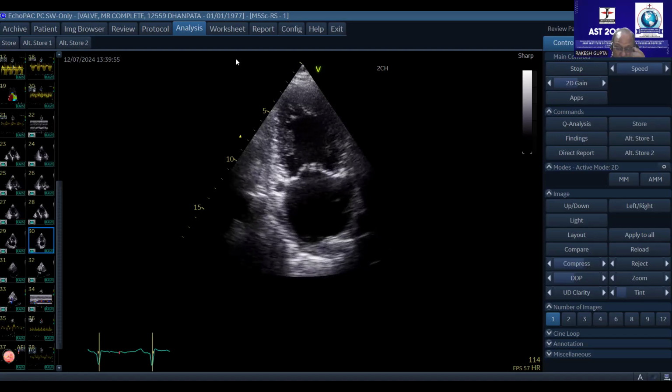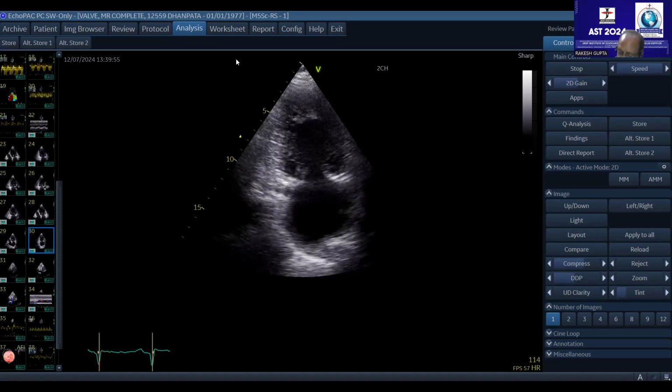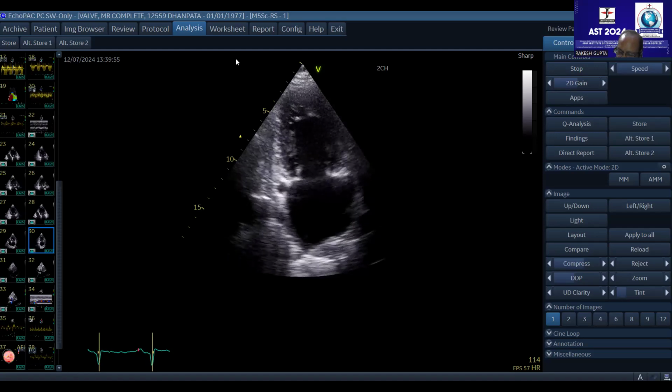Yeah, sir. We have to calculate the PISA method and the regurgitant volume, and also the MR jet area divided by the LA volume to measure the severity of the MR. And we also have the dilated LA and LV and the systolic reversal of the pulmonary vein. That's all I'm asking you. I'm not asking more than this, man. That's all I asked you. Okay.